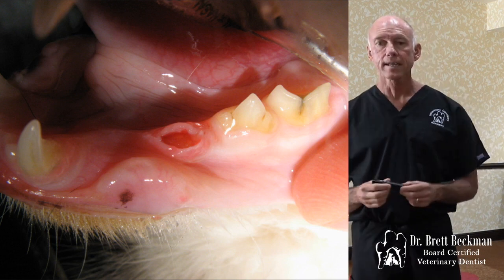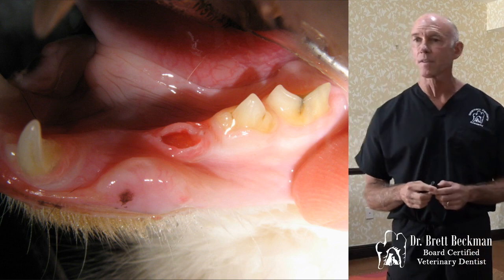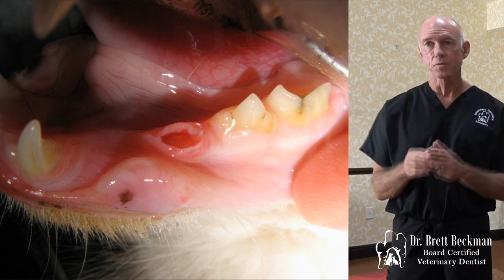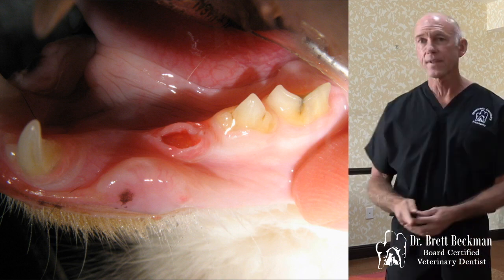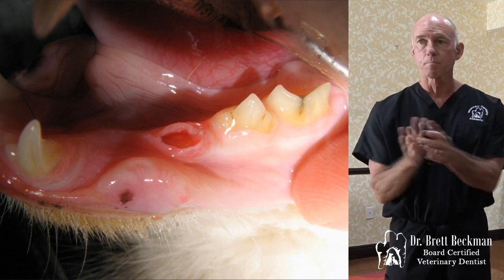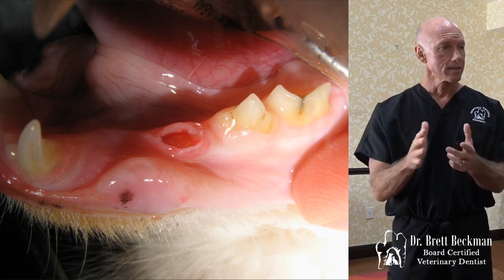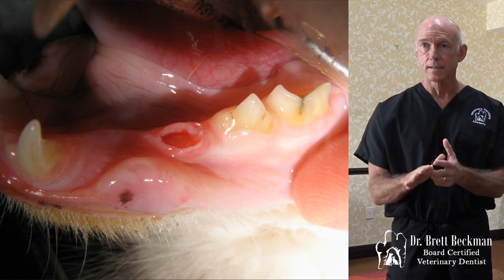When we're doing the approach to this, we just make a little incision, mesial and distal, on the marginal bone, just like we were going to do an envelope flap, only it's really a millimeter or so on each side. Then we use our periosteal elevator to open that tissue up like you see here, so that your burr is not going to ding the gingiva, and you've already got enough mobility in that tissue to close it once you're done.